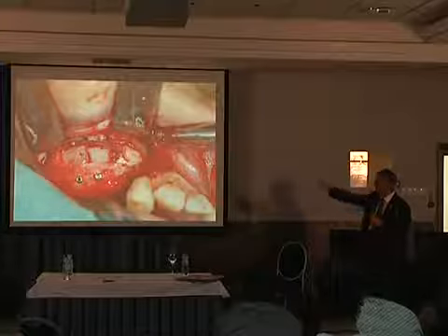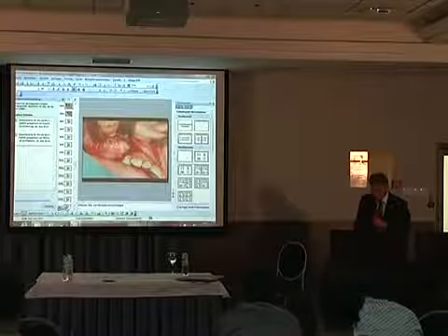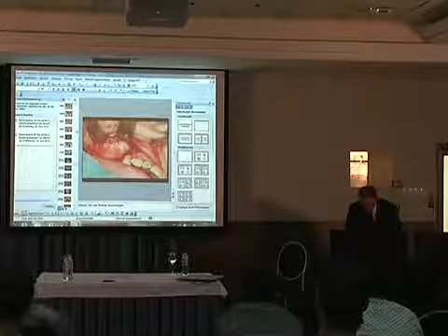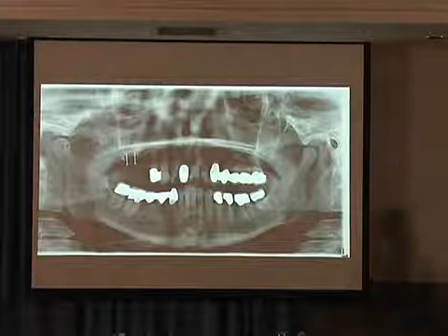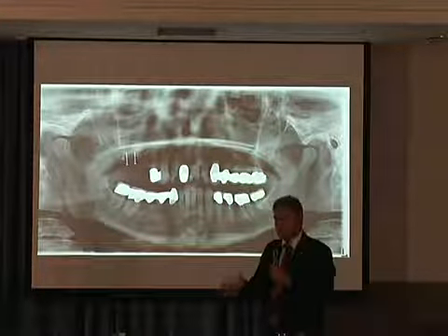Parts of the remaining window. Часть закрывается оставшегося окна, полностью закрывается материалом. Membrana. And then here we go. I think that's it. And this is then the final result. Окончательный результат. Вы видите винты, которые фиксировали костный блок.